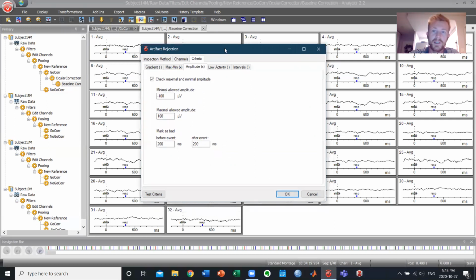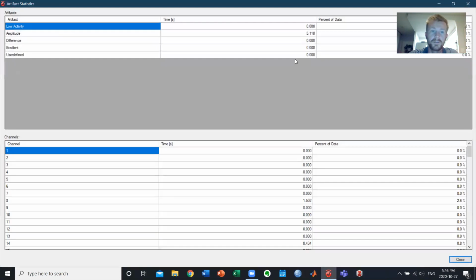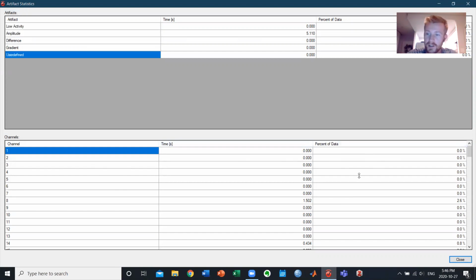So before we apply this criteria, we're going to go ahead and test it. And this is going to show us with the criteria we've described what percentage of our data, what amount of time of our data is going to be rejected from this criteria. So here you can see there's a list of each channels, and on the right, I'm looking at the percent of data that was removed with this criteria.